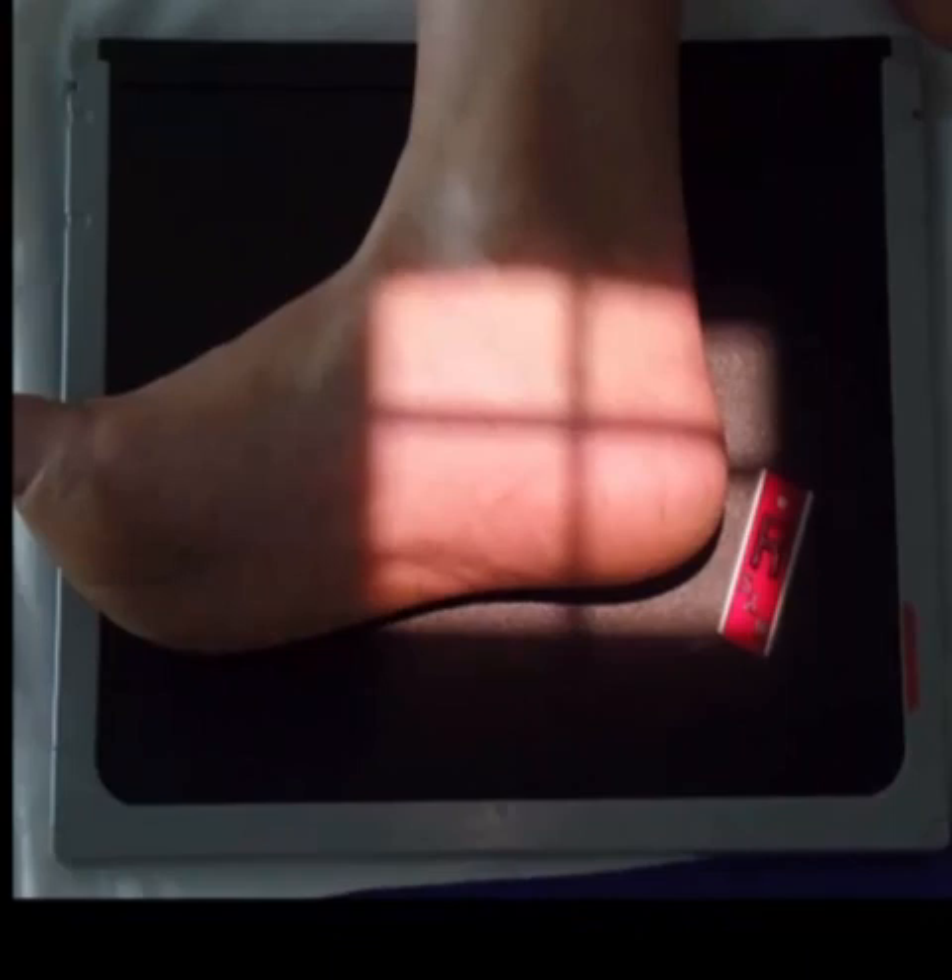Center the calcaneus to the IR and direct the central ray approximately one inch inferior to the medial malleolus. Then collimate as demonstrated here.